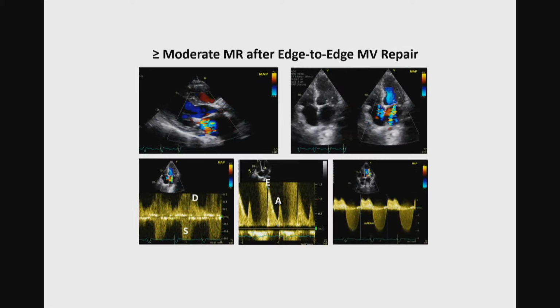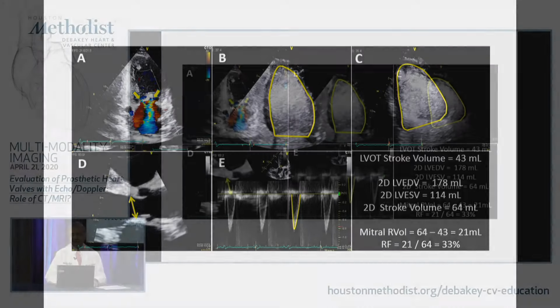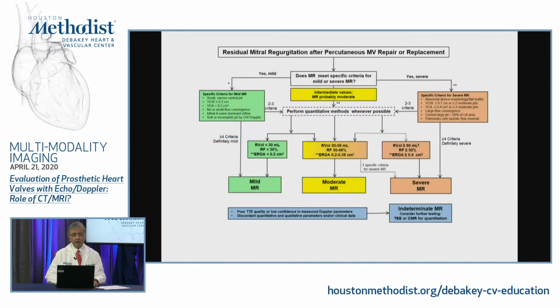But if you have more than that, and with velocities in the mitral inflow that may suggest more significant regurgitation, you have to do more. Not infrequently, a transesophageal echocardiogram, or refer actually to our MRI colleagues to quantitate regurgitation. But if you're going to quantitate regurgitation from ventricular total output and LV outflow velocity, please use contrast to have more adequate ventricular size at end-diastole and in systole, for you to be able to derive a total stroke volume in this situation.